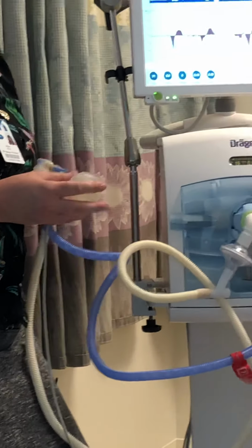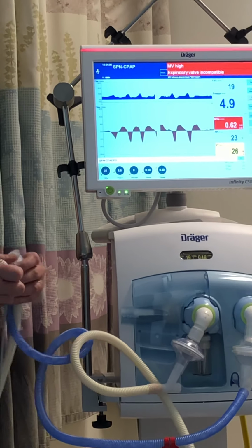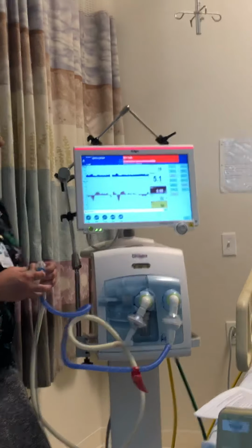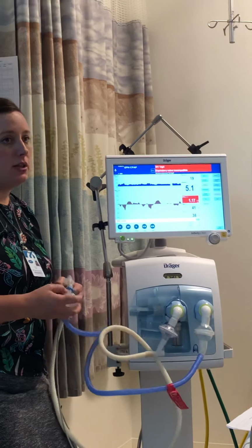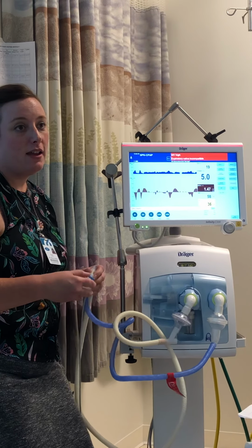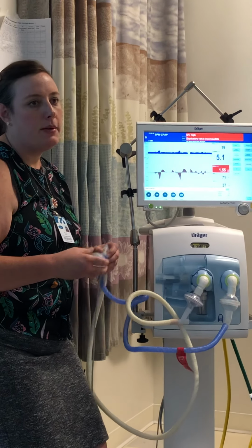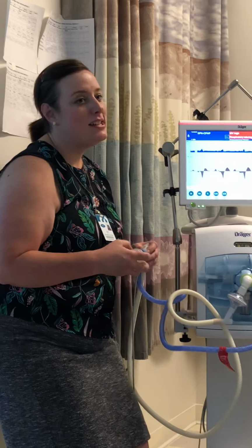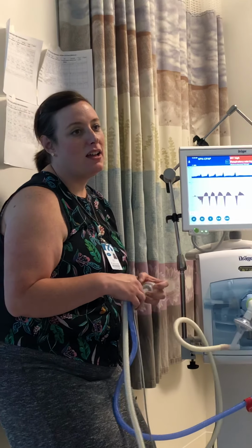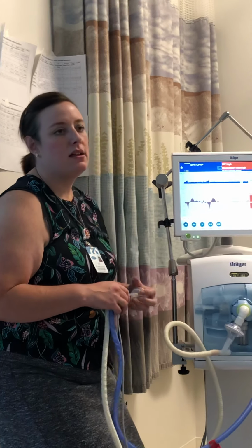They have those at Northwest Community? The flow sensors. Adults, it's the worst. It gets clogged with secretions all the time. How often are you taking that thing out to clear it? No, they just have it on there. You just suction. They never take it out. Does it work? I'm surprised. Hamilton, I know they have it though, because when we set the vents.